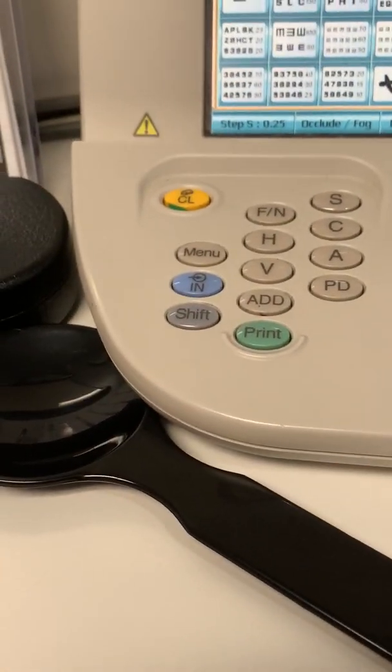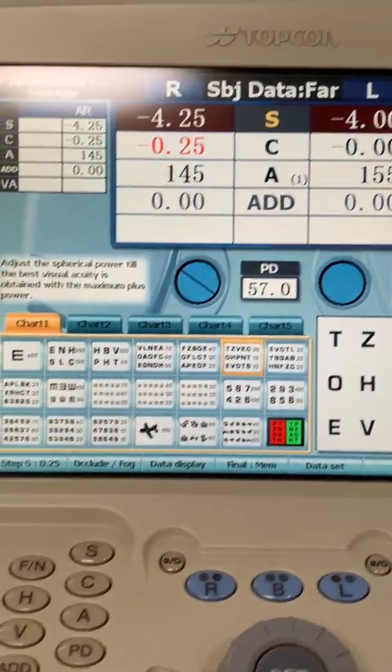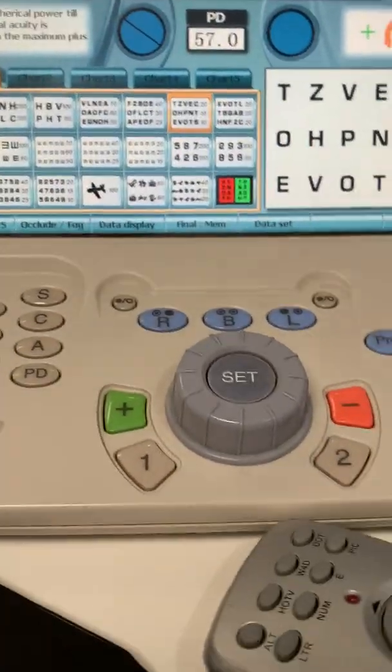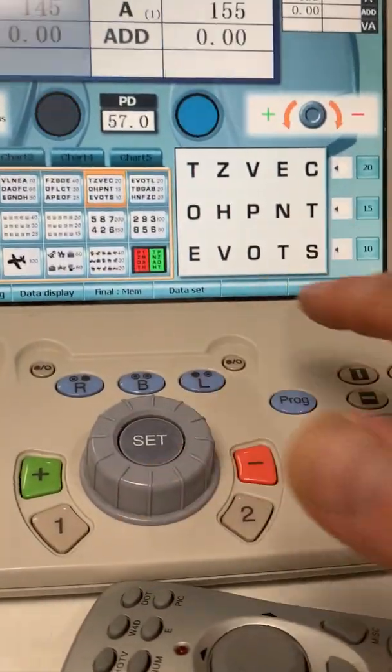So to recap: hit IN, find the number we need, hit OK, and it goes on the screen. Then we can go toggling between the right eye and the left eye — there's the right eye, and here's the left eye.